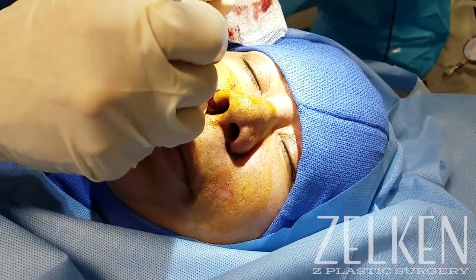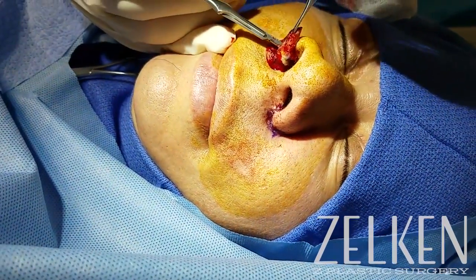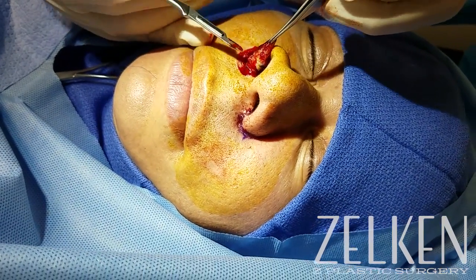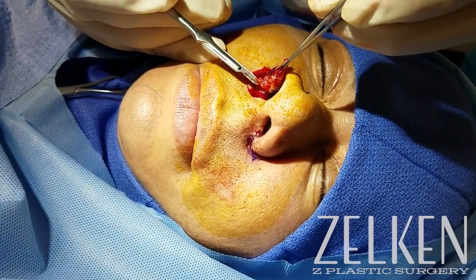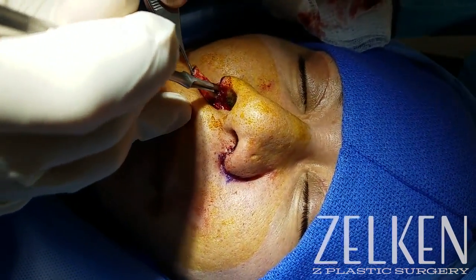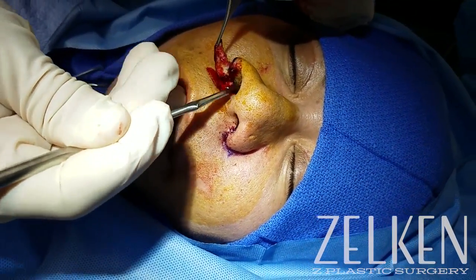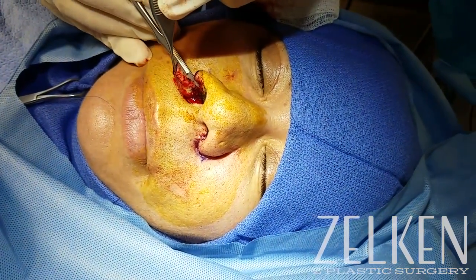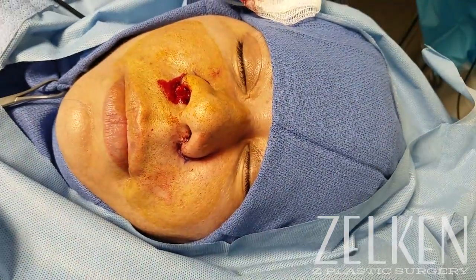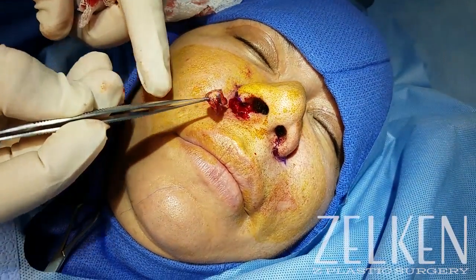On this patient I noticed a slight asymmetry with the nostril base length; however, the lower alar length was about the same on both sides. So I took off a very liberal seven millimeters of tissue on each side, and the apex of this really is at the lateral-most aspect of the lower lateral cartilage in the ala. I'm taking a full thickness wedge resection of this tissue, making sure not to cut any surrounding tissue and to avoid any collateral damage. I do change the angle of the 15 blade when I get inside the nostril sill for that vertical component — and as I take it out, you can see this is not truly a wedge, but there are two dimensions to it; it's more of a chevron.